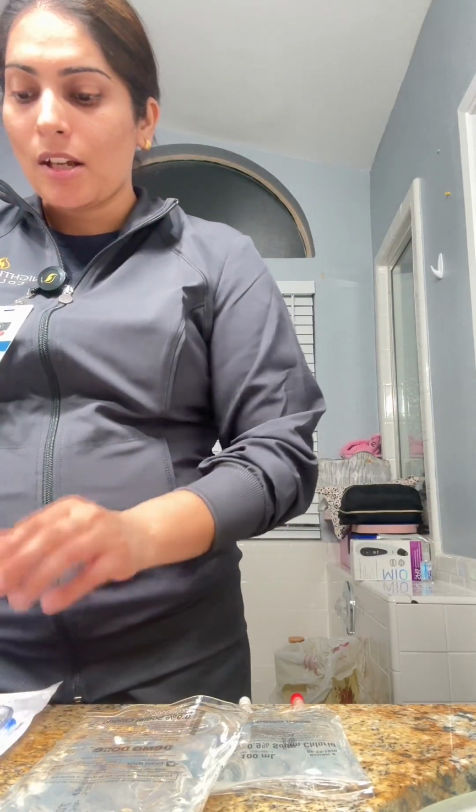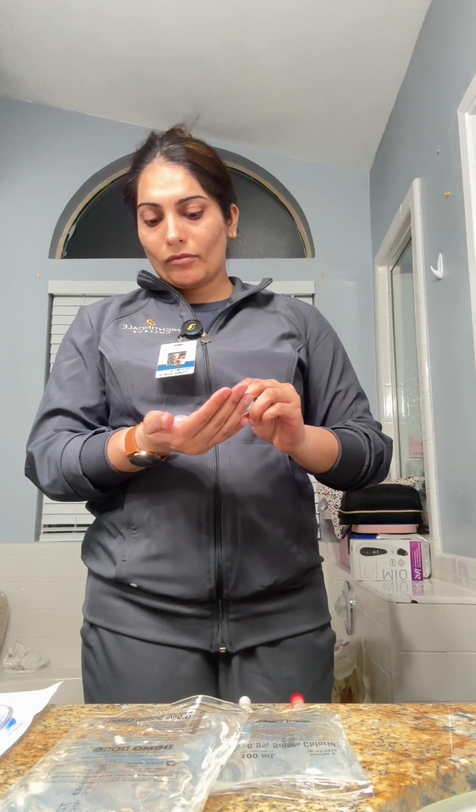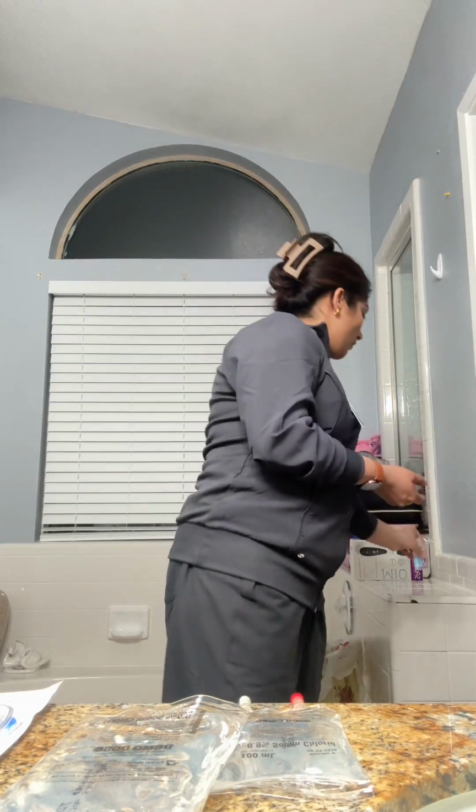drops per minute. I will be asking my patient if they have any allergies to any type of medication, any fluids or anything, and the patient has no allergies. And I will be performing hand hygiene again, and donning my gloves.